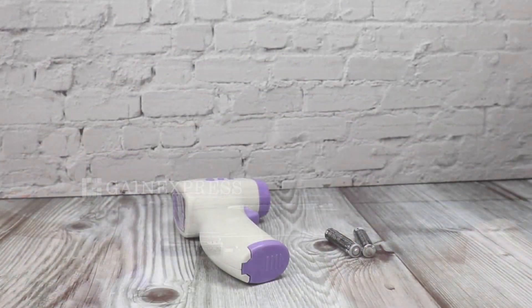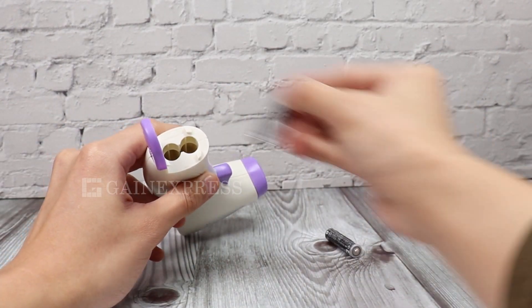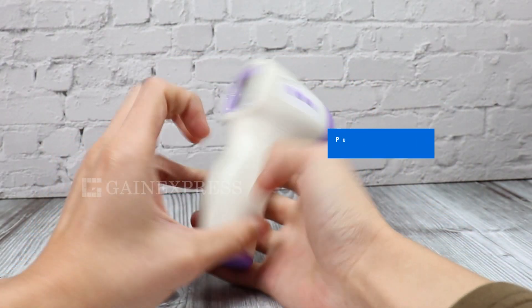To operate, load two pieces of AAA battery. Make sure the batteries are in the correct position. Pull the trigger to start up.